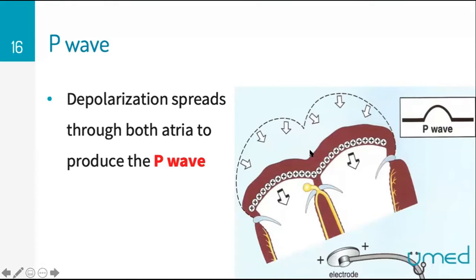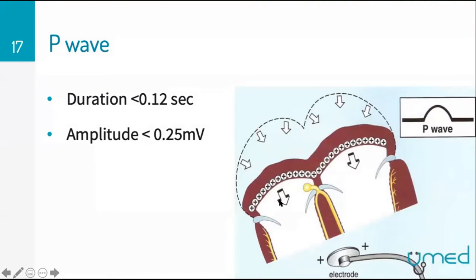It's important that you know what exactly each wave represents and what each interval represents. They can ask you things of that nature, like what does this wave represent, or which of the following refers to this particular interval. So you'll see that as I dive further down. Ensure you know what the P wave represents, the QRS complex, your T wave, etc.